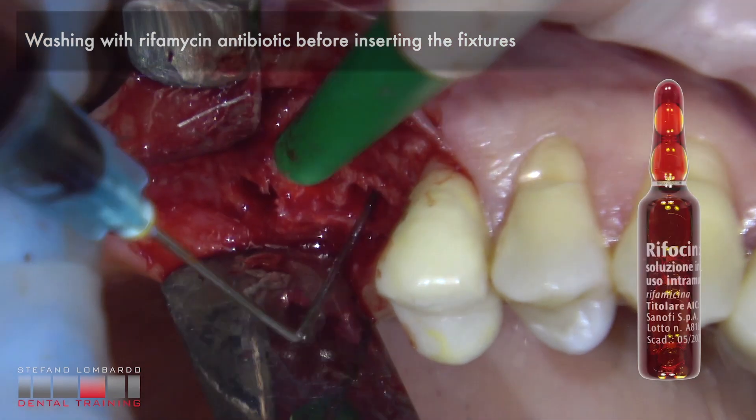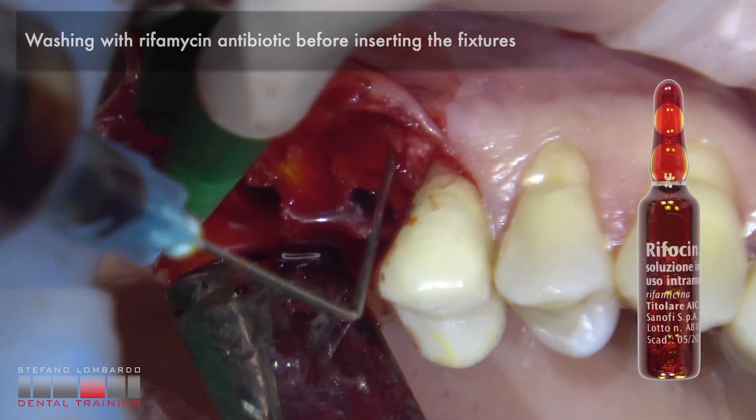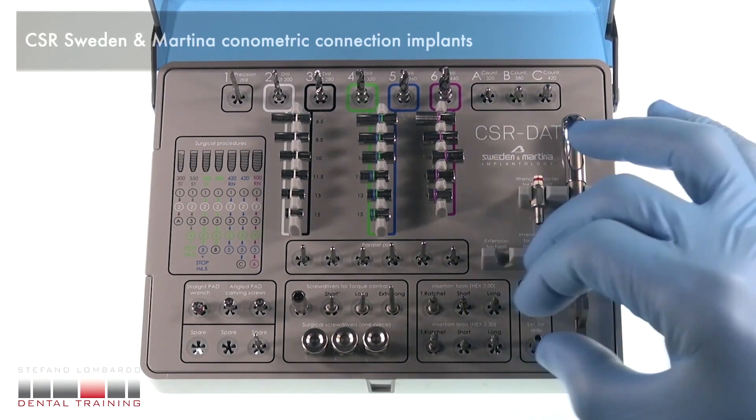Washing with rifamycin antibiotic before inserting the fixtures. CSR by Sweden and Martina — conometric connection implants.